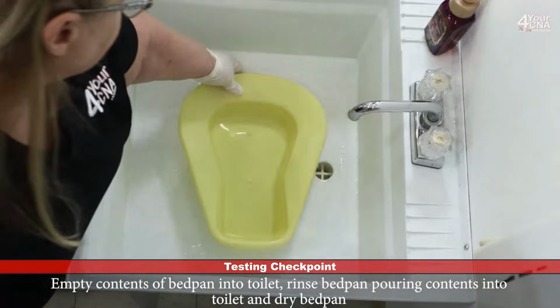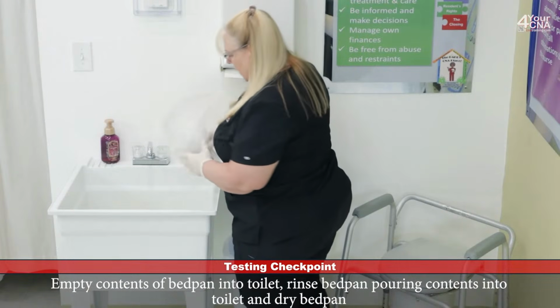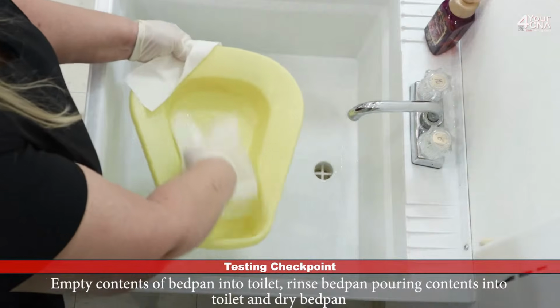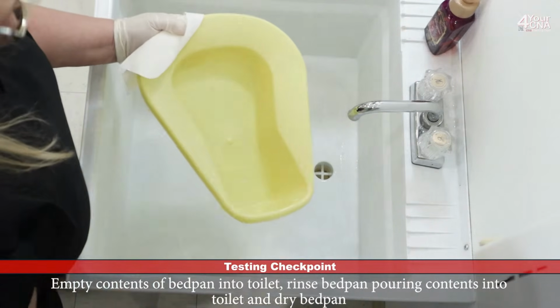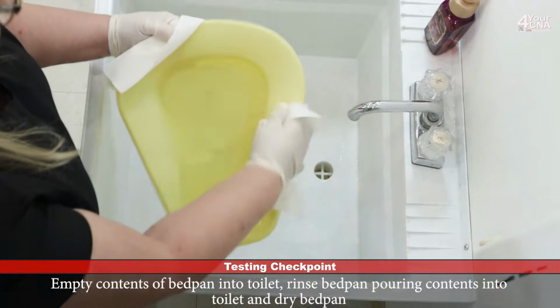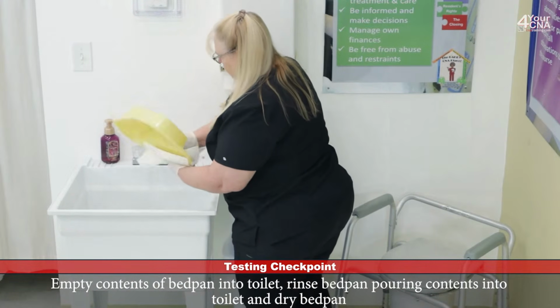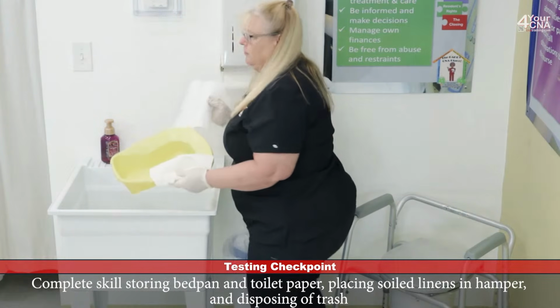Now I'm going to set the bedpan down into the sink, disinfect it per facility policy, and then use a paper towel to pick it up. I'll take a paper towel to dry the inside. Throw that away. Another paper towel to dry the outside. Throw that away. And then one more for the drawer.